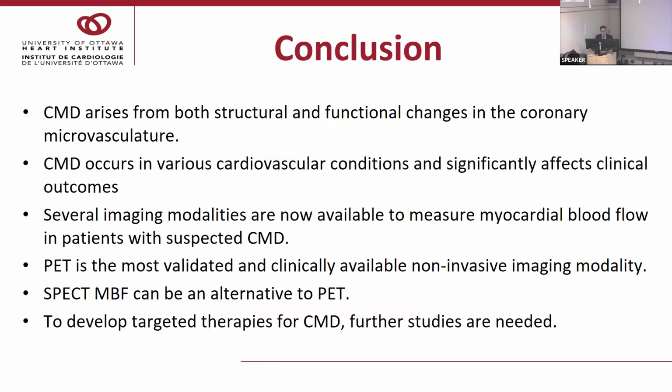In conclusion, CMD arises from both structural and functional changes in the coronary microvasculature. And CMD occurs in various cardiovascular conditions and significantly affects clinical outcomes. Several imaging modalities are now available to measure myocardial blood flow in patients with suspected CMD. PET is the most validated and clinically available non-invasive imaging modality. SPECT MBF can be an alternative to PET. And to develop targeted therapies for CMD, further studies are needed.